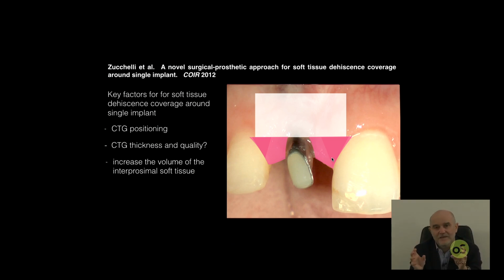Exactly in the same way we treat single type gingival recession, we make large trapezoidal type of surgical papilla so they can join, in this case, with trapezoidal anatomical papilla, desepithelialized, and so to give such a wide connective tissue contact, surgical above anatomic papilla in the interproximal area.